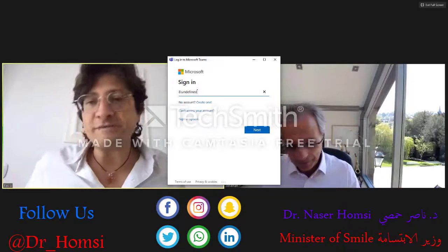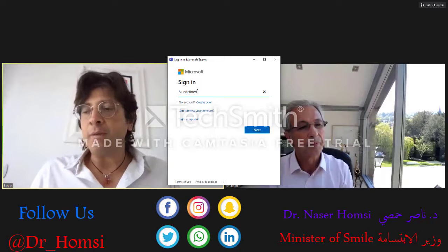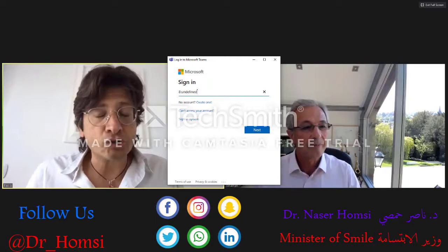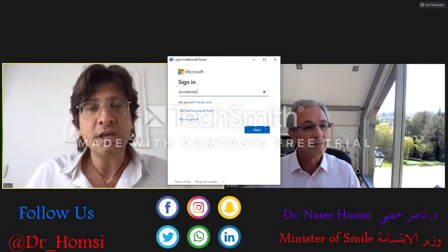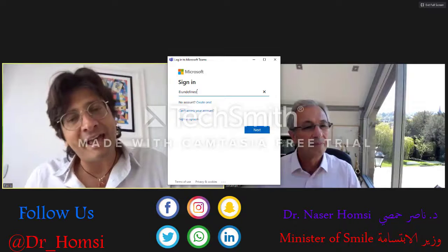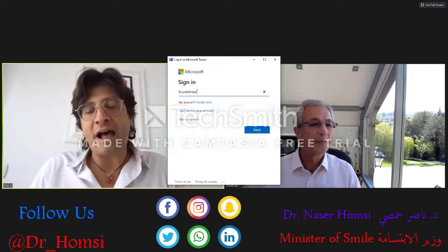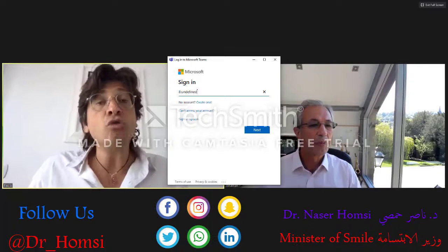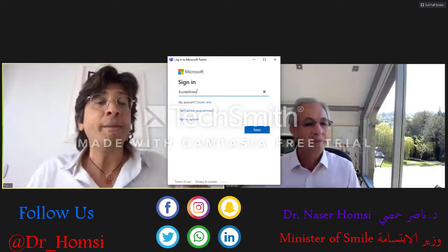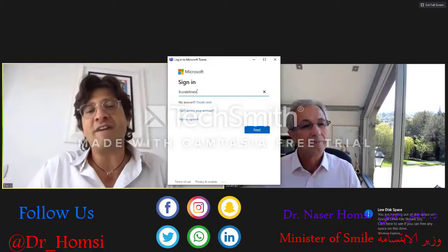Thank you very much, Jonathan. This is a very interesting question. Yes, now I measure every patient, because, as I told you, it can be very dangerous not to measure, as you can miss patients who have some discrepancies. Before, I did this by hand with a high-accuracy digital caliper. Now I do it in all patients with scanning technology. I use the 3Shape tool, and the Bolton discrepancy measurement takes one minute. It's very fast and very easy.